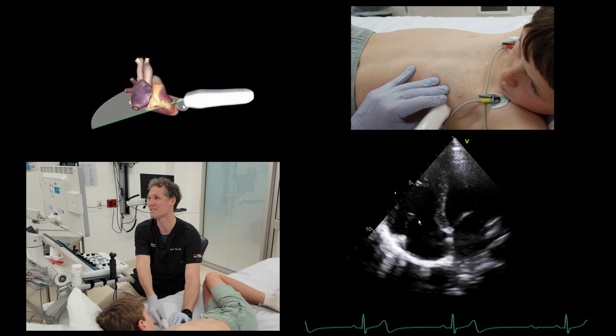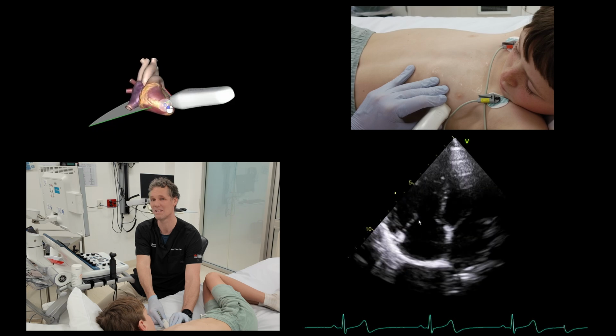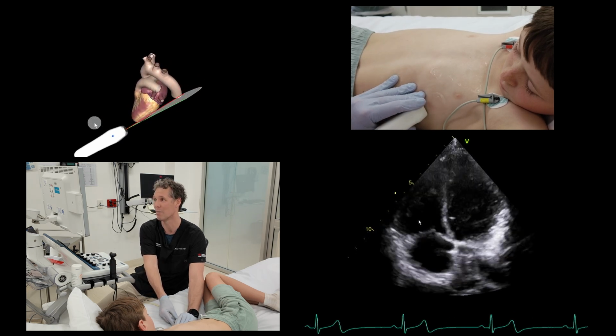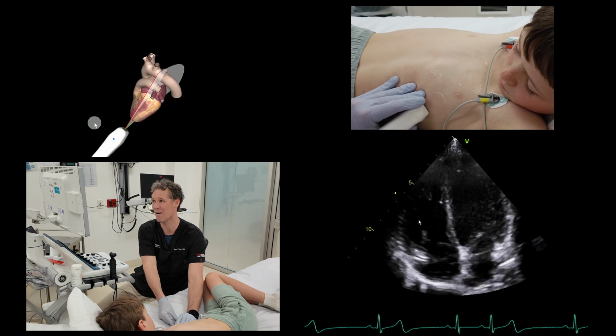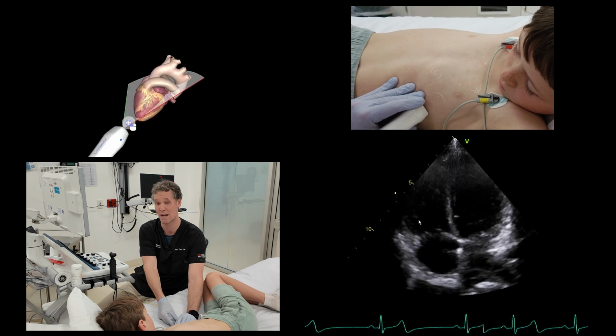Can I demonstrate that? You see how the heart looks spherical, right ventricle looks enormous, big as the left ventricle, and that's different than if I'm a couple of rib spaces lower and looking up. And again, maybe that highlights the importance of, before you start saying the right ventricle is big in one view, you've got to look at it in multiple views.